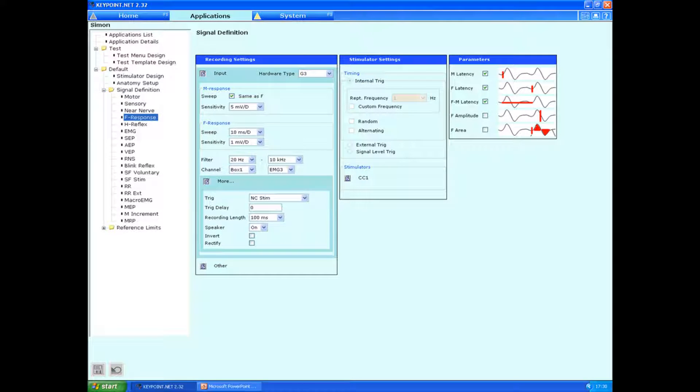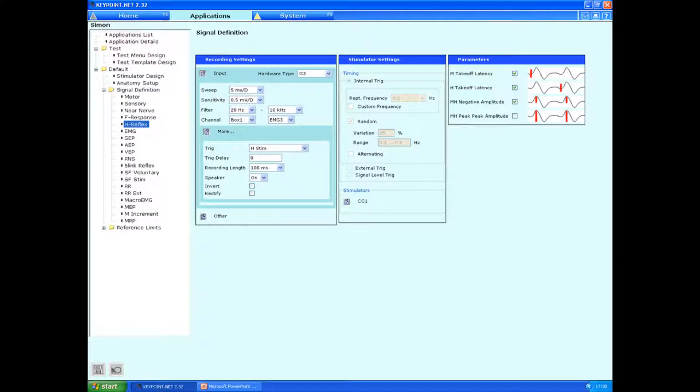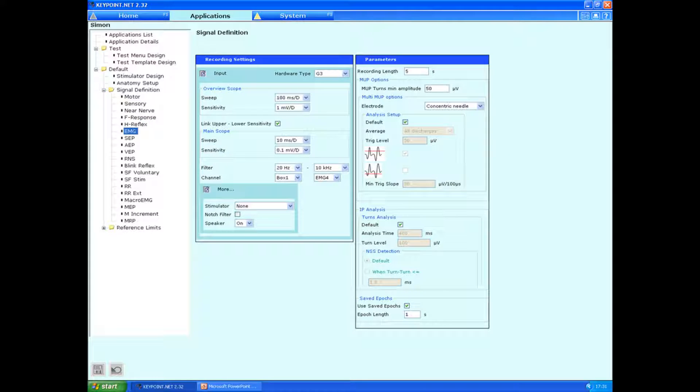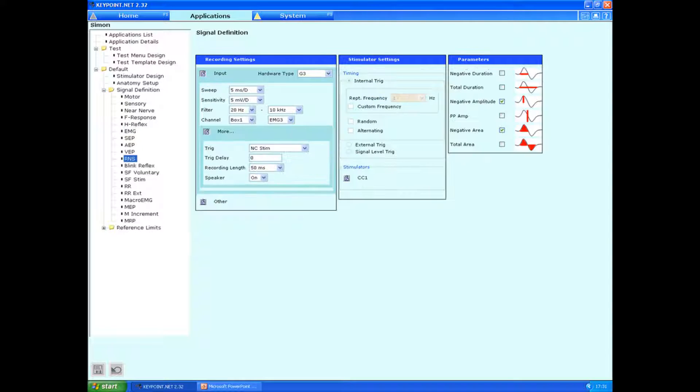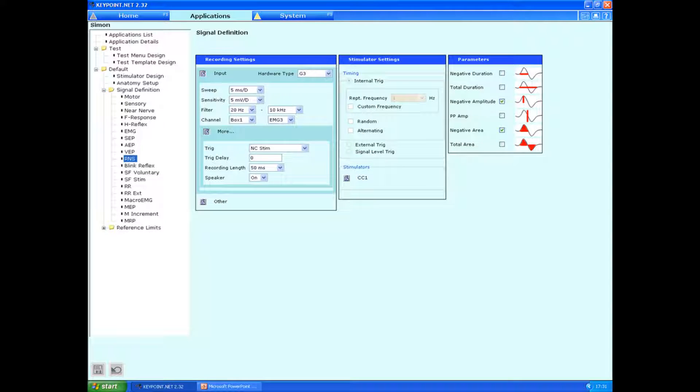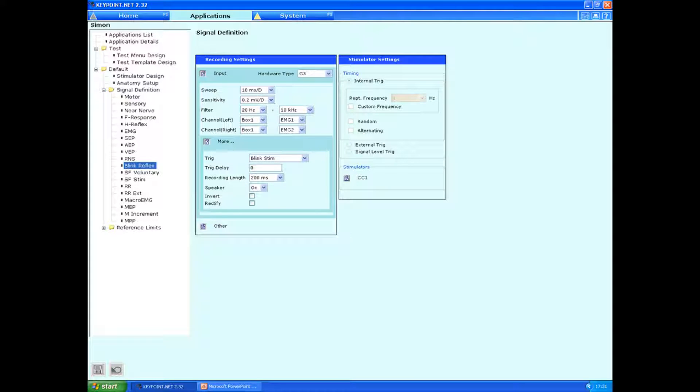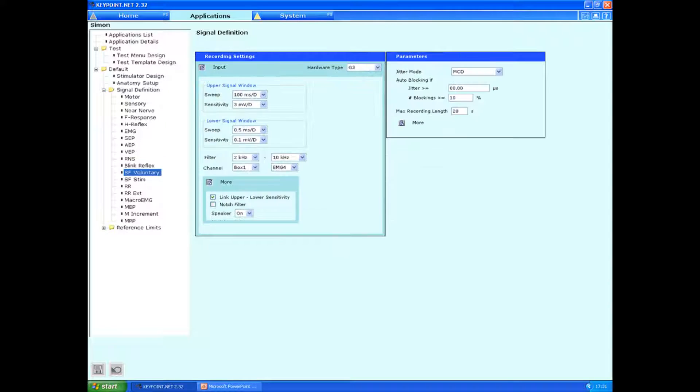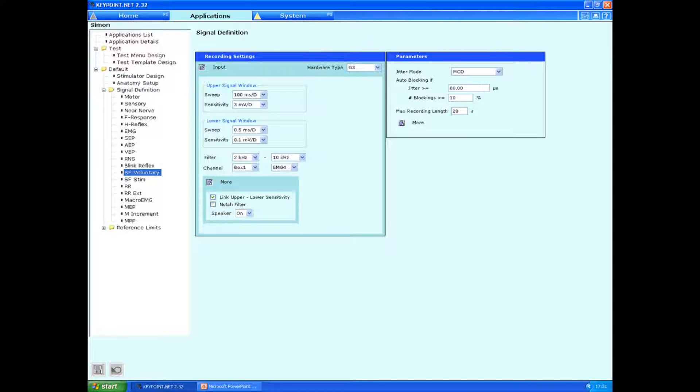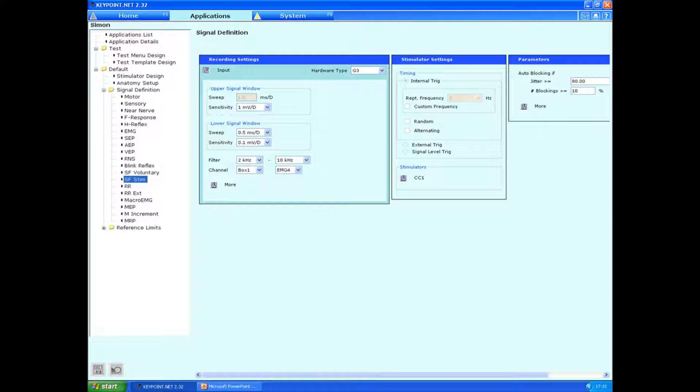These are the sensory settings, F responses, H reflex, EMG settings, repetitive nerve stimulation, blink reflex, single fibre voluntary, single fibre stimulator.